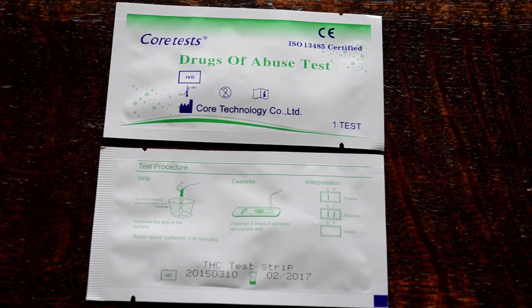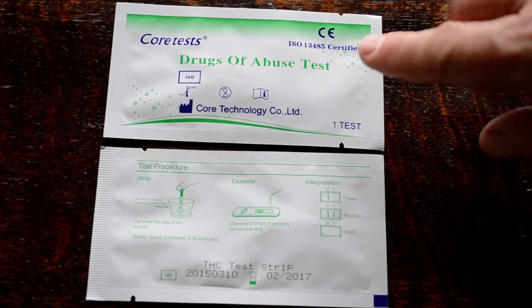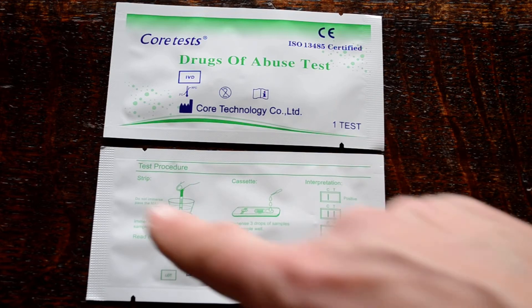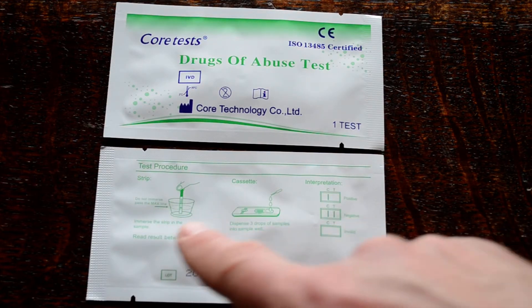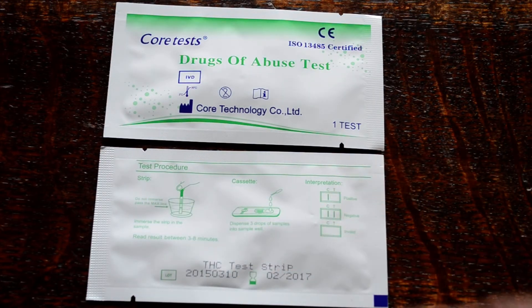Welcome to this video demonstration of the CoreTest Cannabis Testing Strip product. These are sold individually by UK Drug Testing. Shown here are the foil front and reverse. You've got the ISO certified CoreTest branding of Drugs of Abuse Test. It contains one test per foil, and on the reverse of the foil you'll see simple test procedure instructions for this strip test, but also the cassette test and indicative result windows of how to interpret the tests.